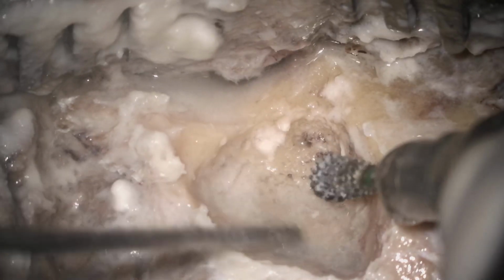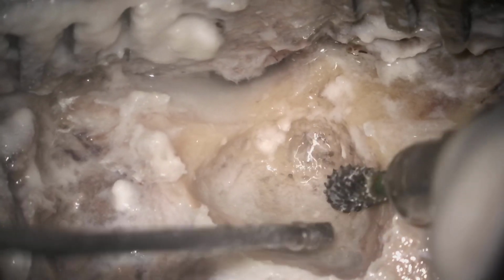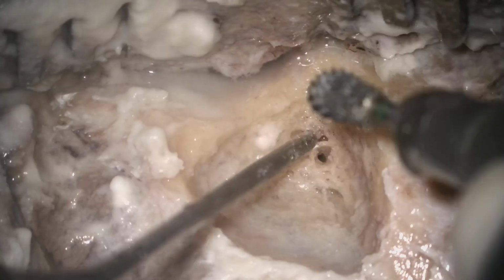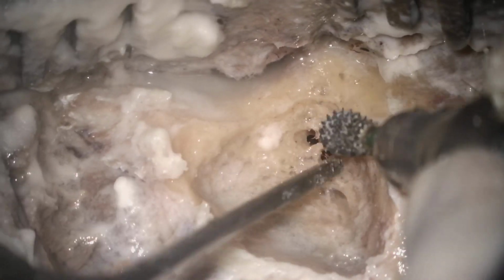So always try to make the contact on a single surface, not on that side, not on that side. If the contact is on both sides like that, then the bur will be jerky. There will be some jerky movement, and that can actually damage. So always keep your eye on the rotating bur. That should be in the proper position, and the contact should be on a single side of the bur, not on both sides or on the surrounding structure.